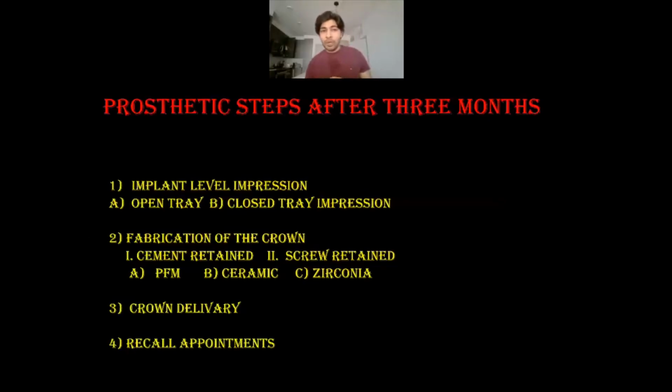I'm not a prosthodontist, but I also went ahead and restored this case. I broke it down into 4 prosthetic stages. The first stage is the implant level impression, which could be an open tray or closed tray impression. The second step is fabrication of the crown. The options are a cement-retained crown or a screw-retained crown. The material of choice could be porcelain fused to metal, ceramic, or zirconia. It's up to the dentist.